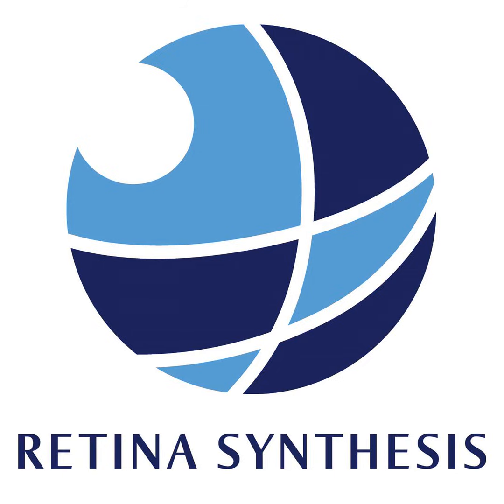Well, I think speed is one of the most important things. The speed of systems is what limited the earlier versions of most devices from creating wide field, because the faster you can scan, the higher the resolution, obviously. And if you're going to look at capillary level changes, or small vascular changes, you need to have resolution at around capillary level. So if you can't scan fast enough, then it's not going to help to look in the periphery, because you're just moving a small field out to the periphery.